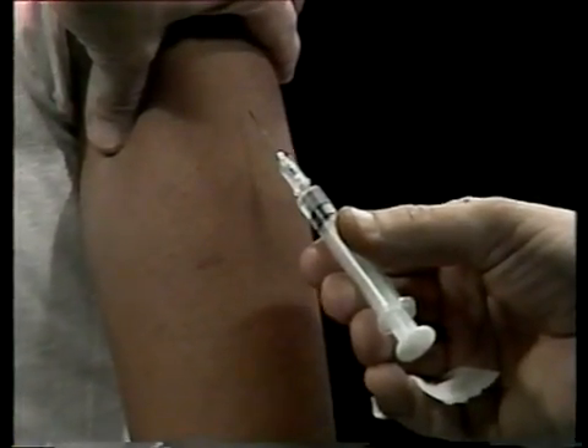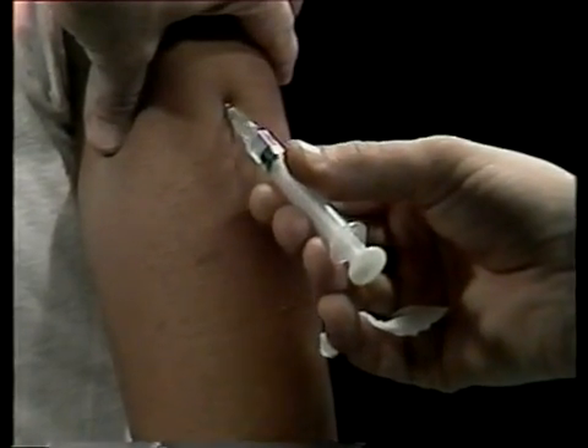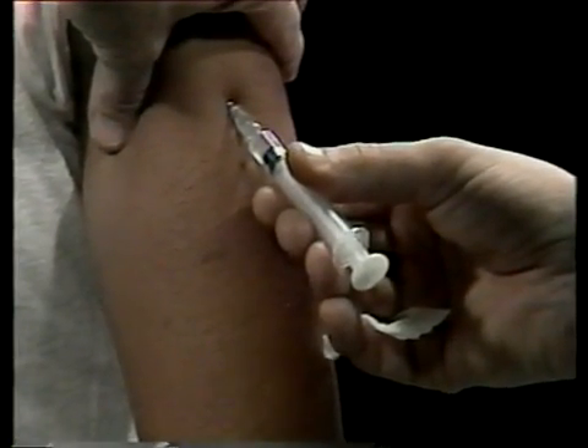Insert the needle at this 45 degree angle into the skin. Insert it with a firm, quick forward thrust.